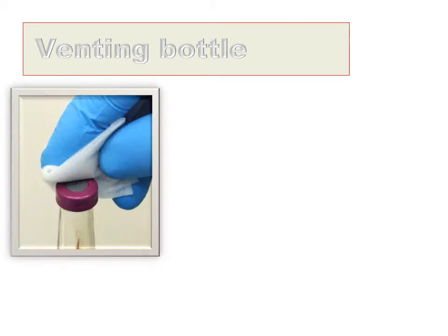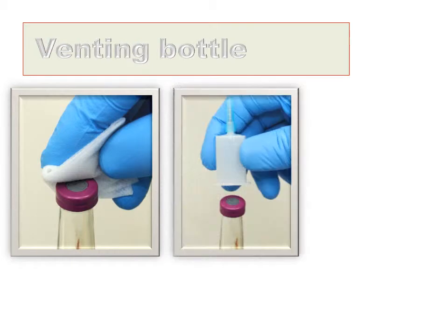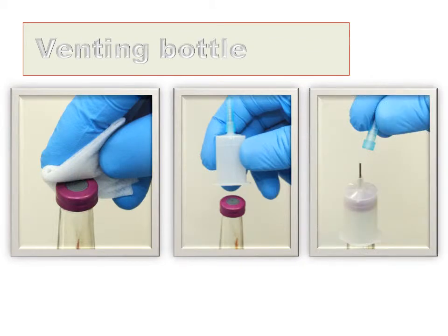Next is to vent the blood culture bottle. Clean the top of the bottle with the alcohol wipe, and then place the venting needle over the top of the neck of the bottle and press home firmly so the internal needle penetrates the rubber membrane. Then lift off the plastic cover.